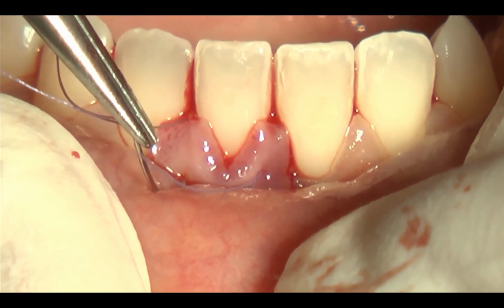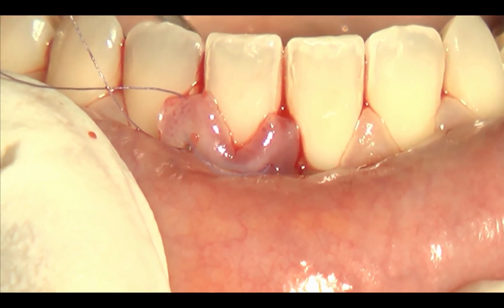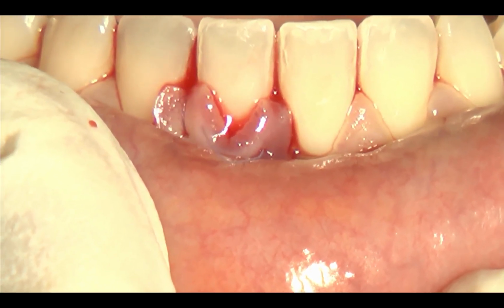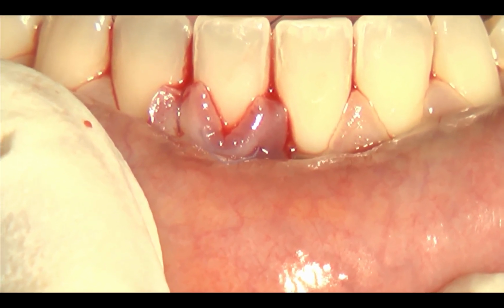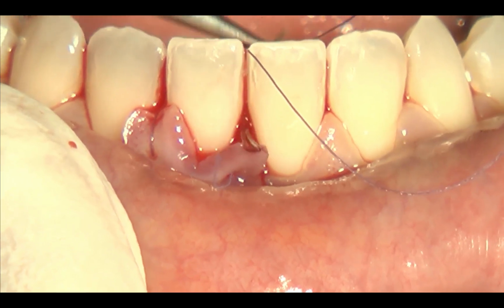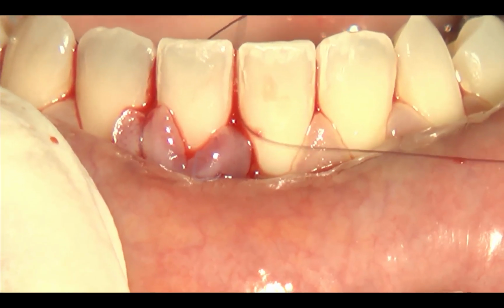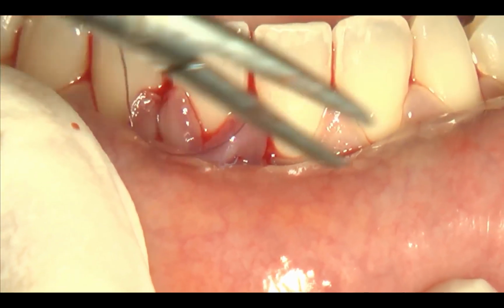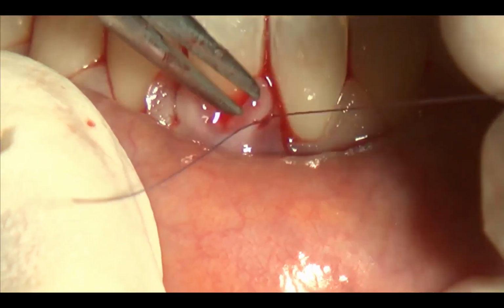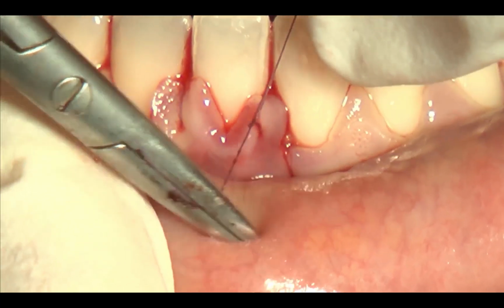Again, surgical, anatomic papilla. I will check for the compression of the suture material in the middle. Then I go back at the starting point. And now I close. I don't want to achieve ischemia in this case. I just want to position, to have the final position of the papilla in place.